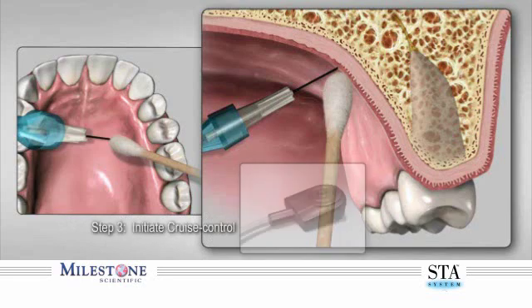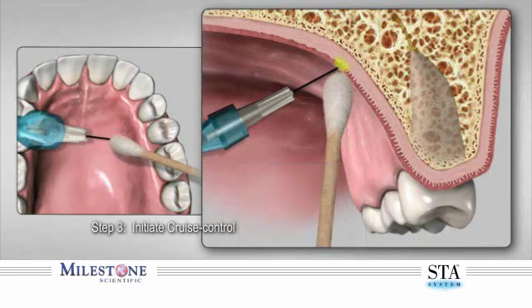Step three: initiate cruise control by depressing the foot pedal and counting three audible beeps. After the third beep, the STA system will announce the word 'cruise.' Upon hearing this, remove your foot from the foot control pedal. The STA system will continue to beep, indicating anesthetic solution is continuing to flow. Allow the anesthetic to contact and diffuse through the outer tissue layers to produce a topical anesthetic effect, numbing the surface. Do not allow the needle to puncture the tissue at this time. Continue allowing the needle to stay on the surface for another four beeps before initiating needle penetration.